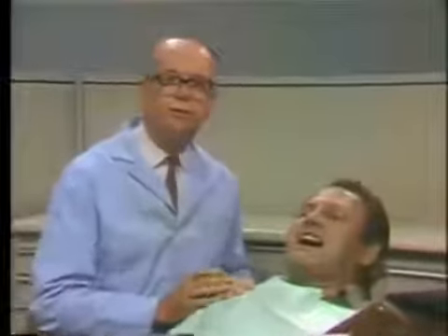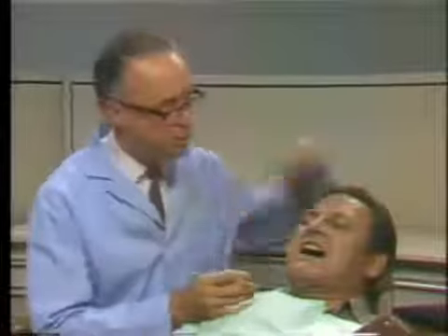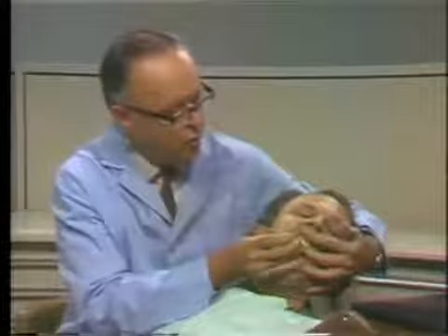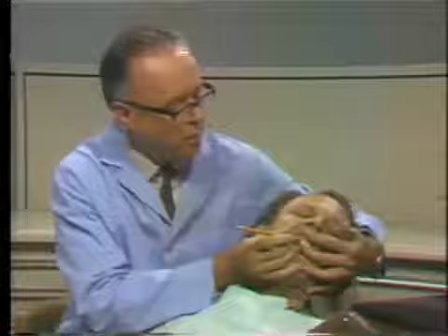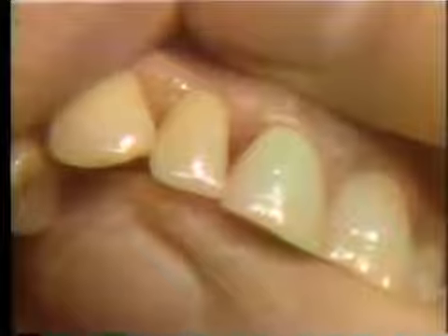You may remember that we use the Pontic facing in position like this, of course, to determine the proximal margins of the pin ledge retainers that we're going to use in this particular case. And if you just turn your head a little that way, good. As you know, we take a pencil and place it on the Pontic facing and into the embrasure as far as we can go, and then draw a pencil line down the adjacent tooth, as you see in that situation there. I think you can just see it.